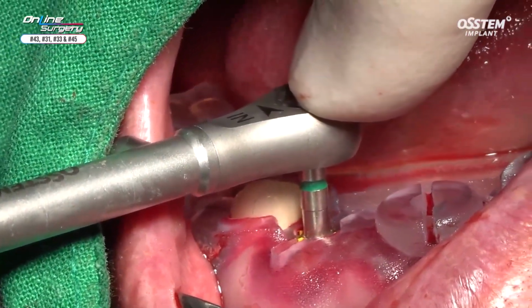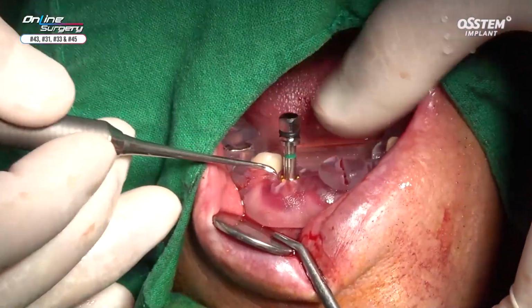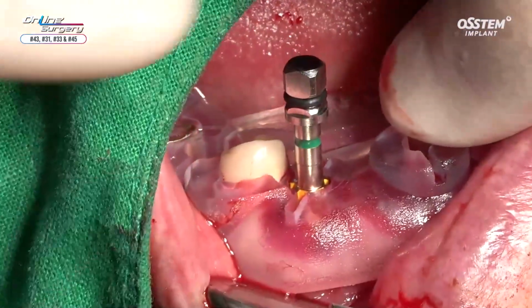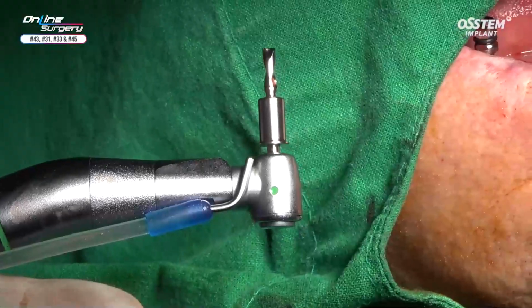It's over 30 newtons. When you take a look, you need to find the height over here. This is adjusted up to the yellow. The depth and path is adjusted. So I'm going to put this in and then move on to the next side.